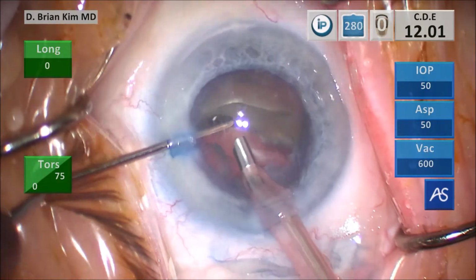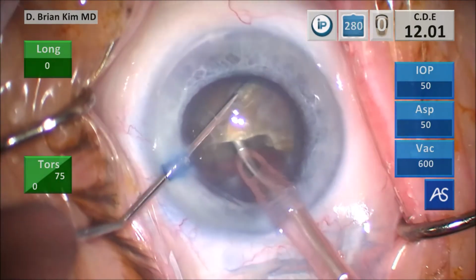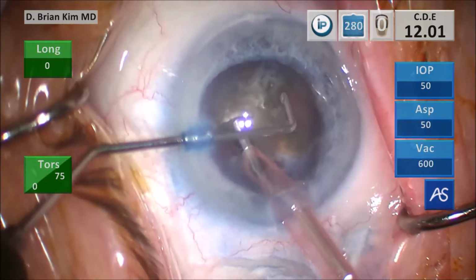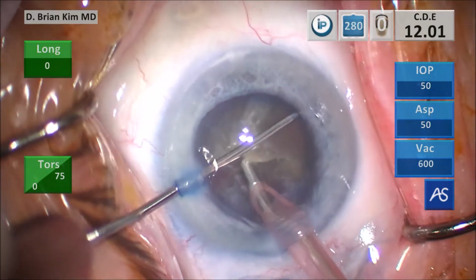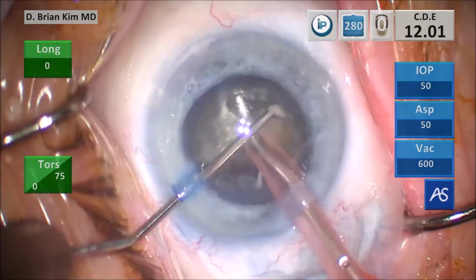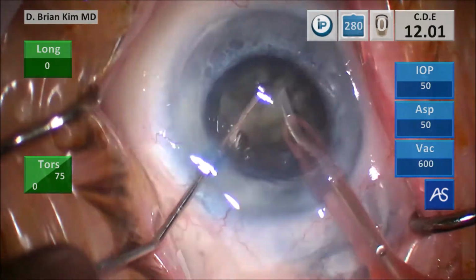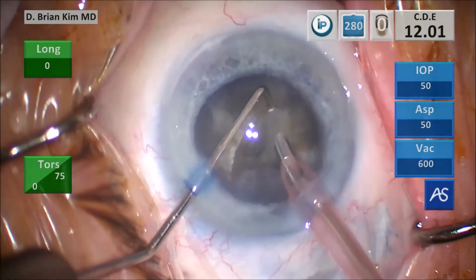Turning that second heminucleus in front of me, placing the chopper with the tip leading off, hooking the peripheral lens. Look how deep that phaco tip is, fracturing the lens completely in half through and through, performing the same maneuver around the third quadrant, having that phaco tip deep. That gives you that complete fracture point. Again, the phaco tip is acting like a chopping block.